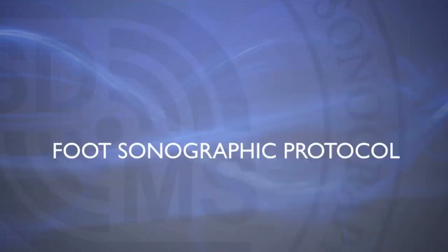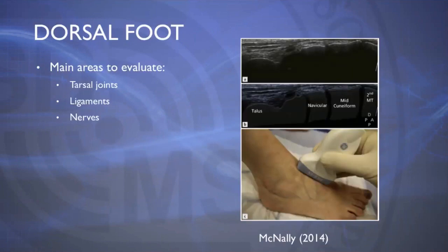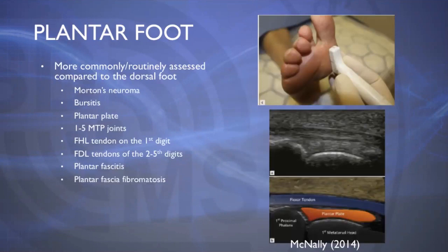Now moving on to the foot sonographic protocol. The main areas to evaluate will be the tarsal joints, the ligaments, and the nerves when we're looking at the foot. On the plantar foot, this is going to be more commonly and routinely assessed compared to the dorsal side.